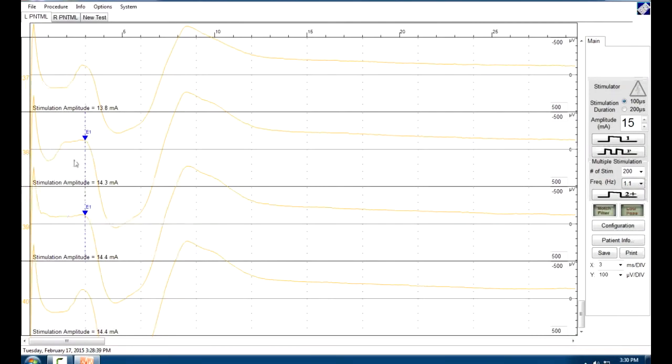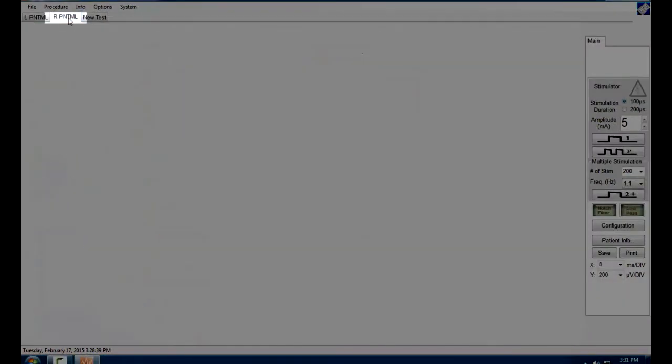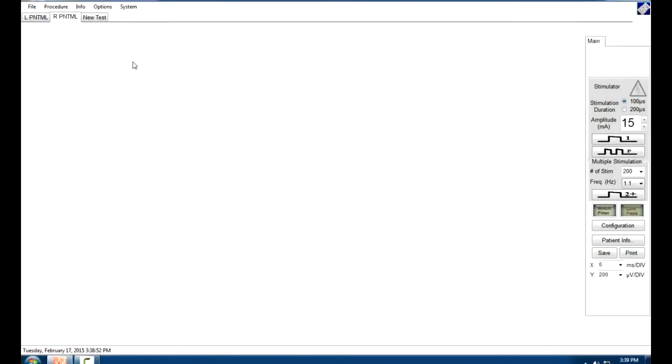This top waveform is much better than the second one I did because you see the spike from when the stimulation occurred. It swoops up, we get a plateau, and then the waveform takes off from there. It's this plateau period that we're looking for. Okay, now we're going to do the right side. You can see up here at the top, it says the right pudendal nerve. We're going to be going there, doing the right nerve.